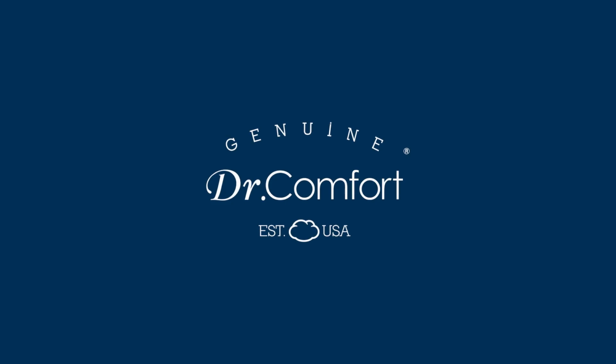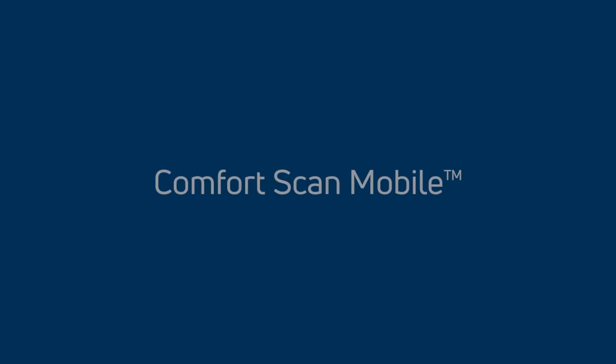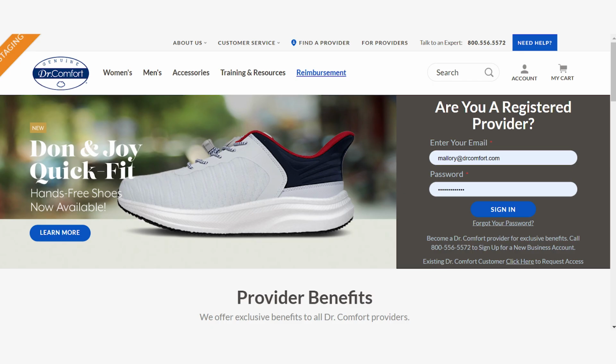Welcome to Comfort Scan Mobile by Dr. Comfort. Scan, fit, comfort anywhere. With Comfort Scan Mobile, the only device you'll need is an iPhone or iPad. Let's walk through the simple steps to capture your patient's foot scans anywhere, anytime.